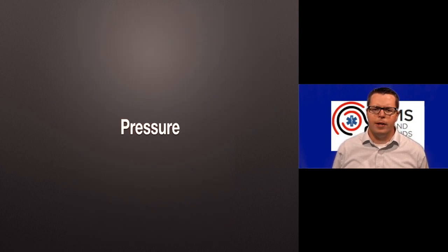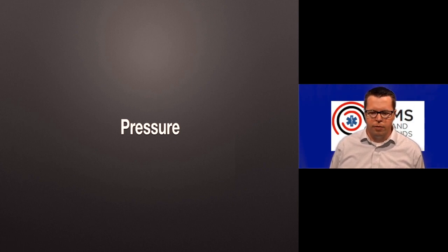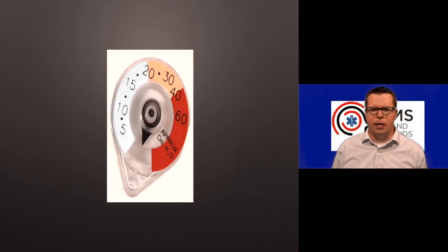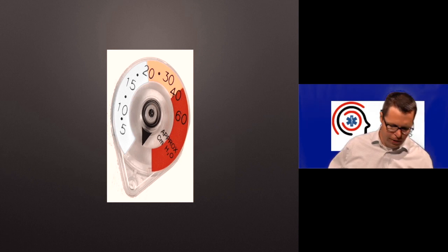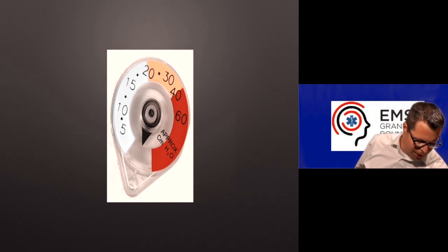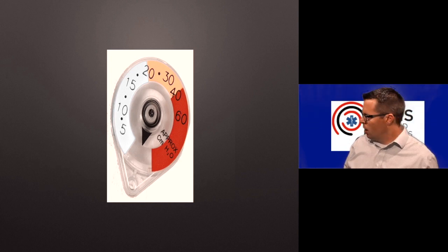How about pressure? The vent usually determines pressure for us and keeps us from overpressurizing because of the alarms and because of our settings. You don't have that on most bags, but what we do have is the availability of little manometers that you can stick on the end of the bag in a lot of cases. So it may go something like here on the side of it. Some of these come with the manometer already on it. It is worthwhile to get one of these things.